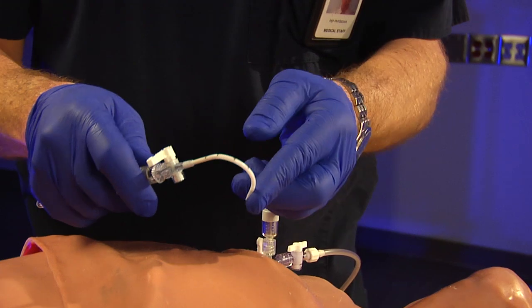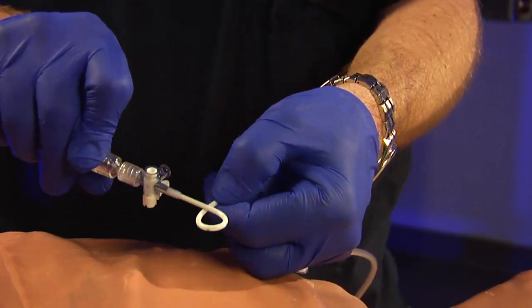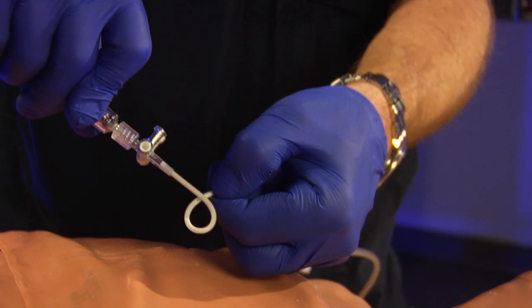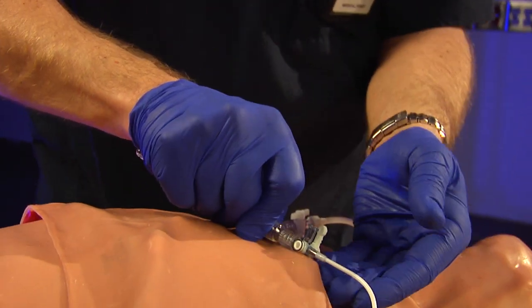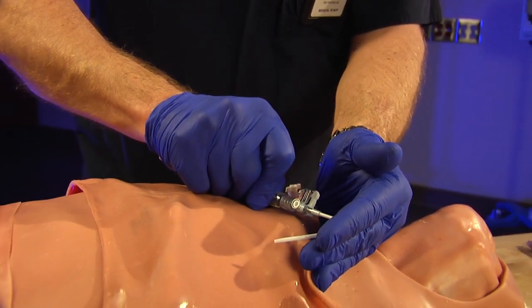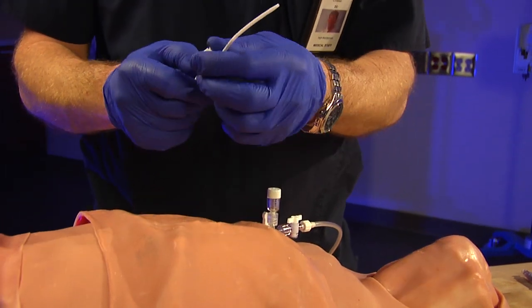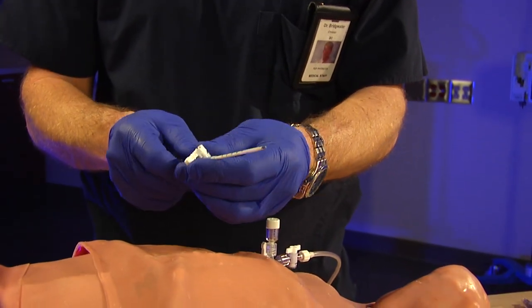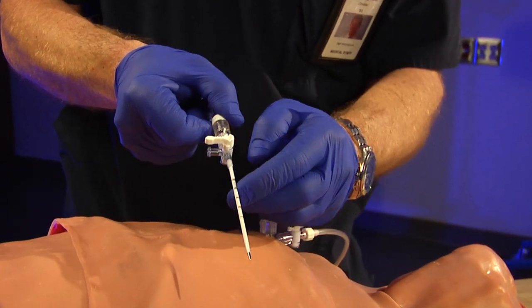Watch as I slide this off — I can bend this almost back on itself, nearly tie it into a knot, and there is no kink. So this can get inside the chest and bend to one side as the lung re-expands without kinking off. This is a much better tube — think of it as a mini chest tube. It's also nicely marked with centimeter markers so you know how far you're going in.